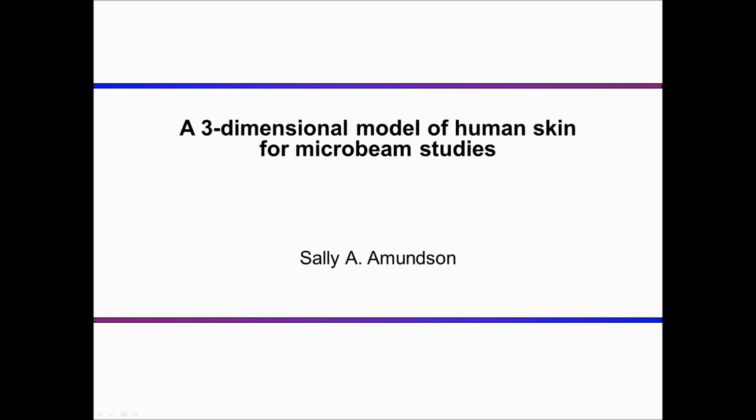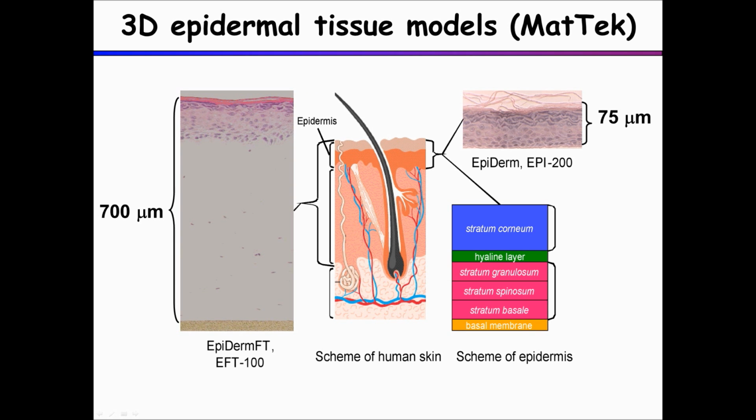So I want to talk about a model of human skin today. We're not actually looking at true intact human skin, but this is a model which approximates skin. This is a commercial product that we get from a corporation called MatTek, and they produce a couple of different flavors of this.